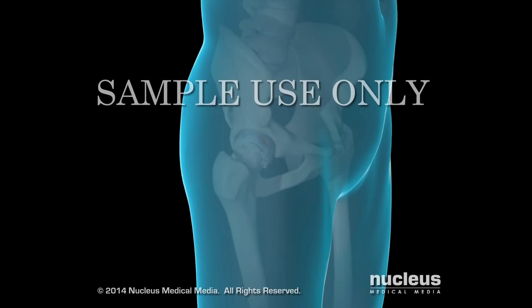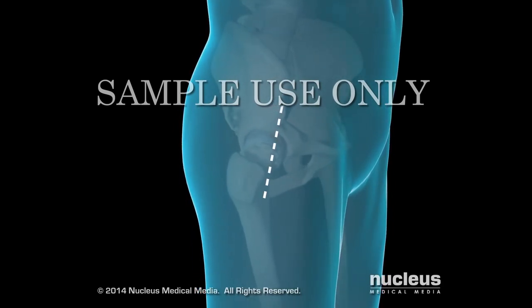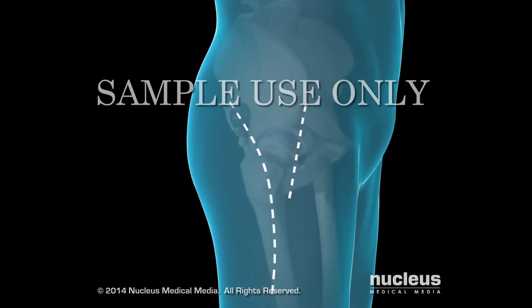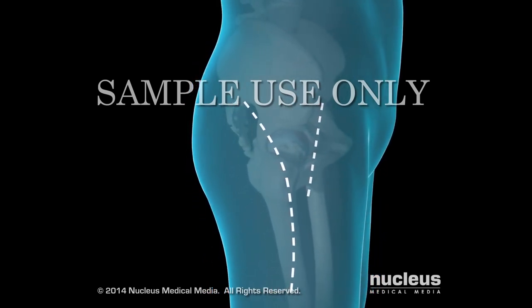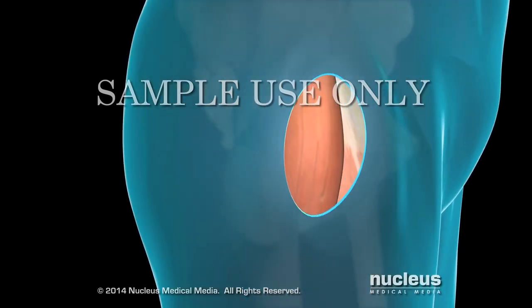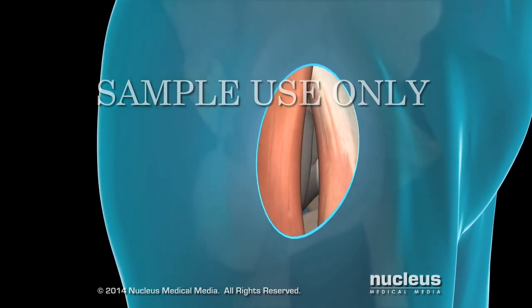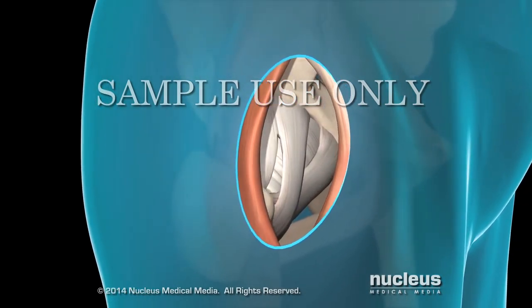Your surgeon will begin by making a 3- to 6-inch incision near your groin. This incision is significantly smaller than those made during other total hip replacement procedures. He or she will then push aside two muscles to expose the joint capsule. No muscles are split or detached during this procedure.